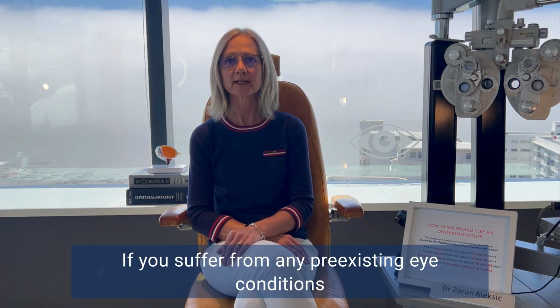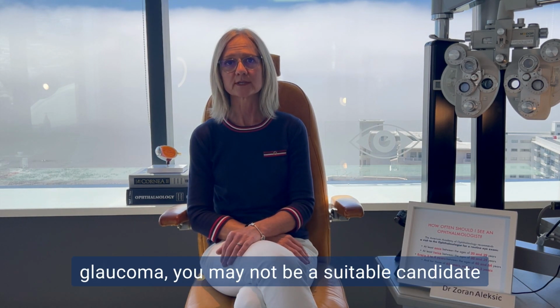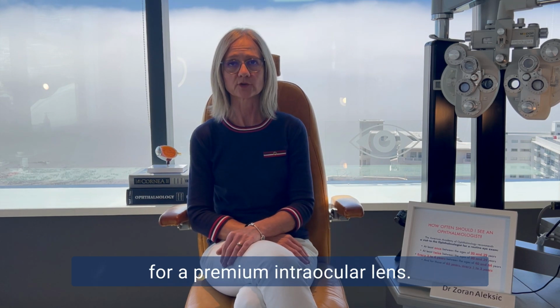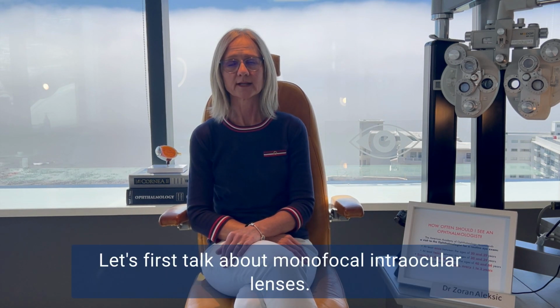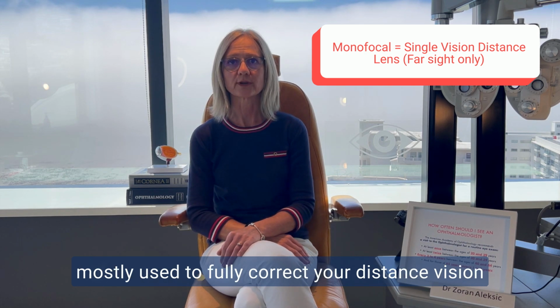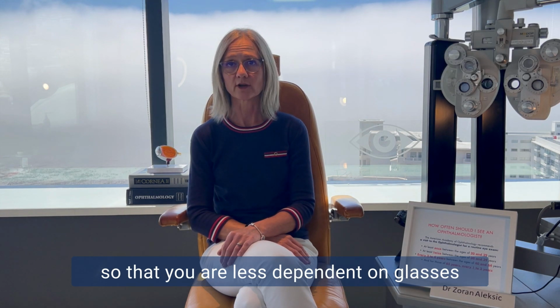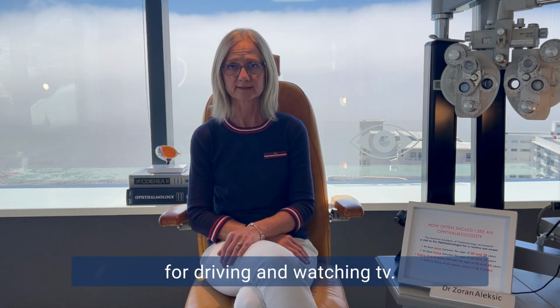If you suffer from any pre-existing eye conditions, such as macular degeneration, diabetic retinopathy, or advanced glaucoma, you may not be a suitable candidate for a premium intraocular lens. Let's first talk about monofocal intraocular lenses. These lenses correct one focal distance and are mostly used to fully correct your distance vision so that you are less dependent on glasses for driving and watching TV.